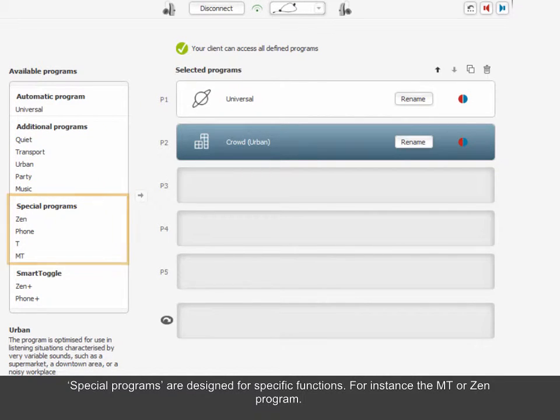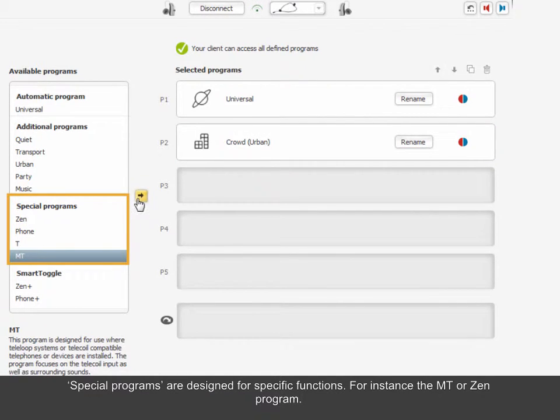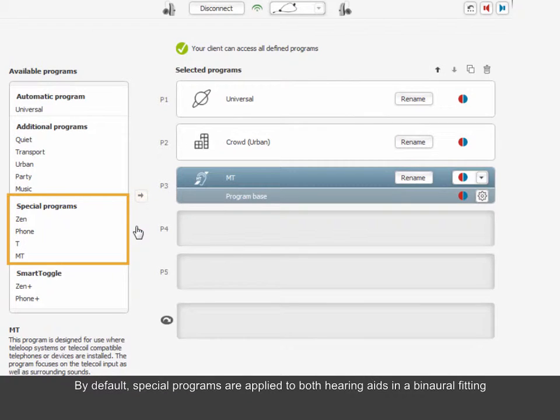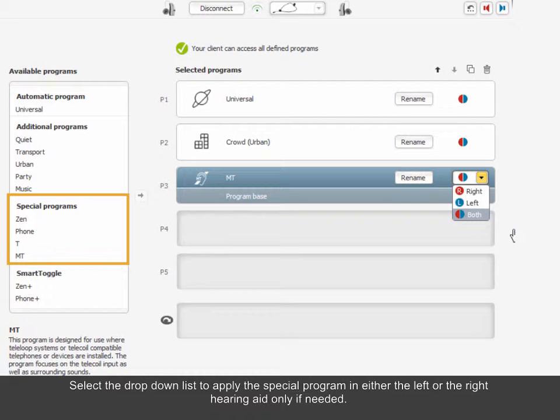Special programs are designed for specific functions. For instance, the MT or Zen program. By default, special programs are applied to both hearing aids in a binaural fitting. Select the drop-down list to apply the special program in either the left or the right hearing aid only, if needed.